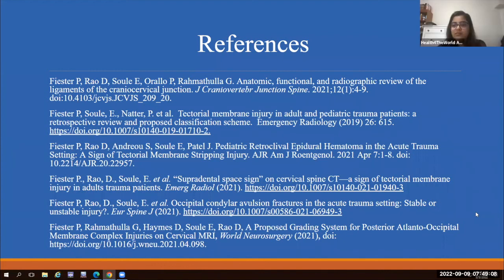So unless there's really overt decapitation, for lack of a better term, on the imaging studies, a lot of these injuries are going to go overlooked, which is not good. So spread the word, and you guys will be the new generation. A lot of you are in training, the new generation of radiologists, to have a more subtle and deeper understanding of this. That's the goal.